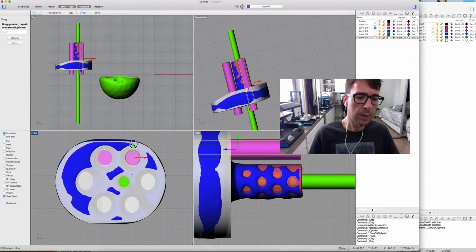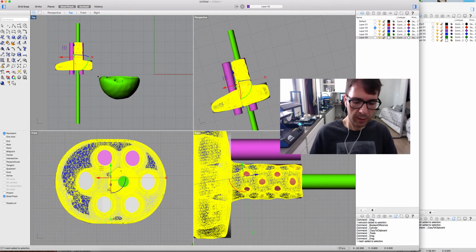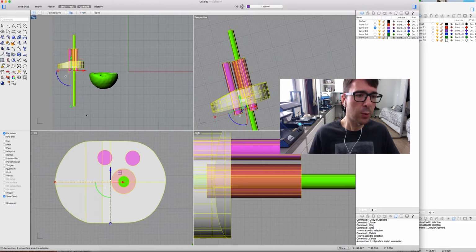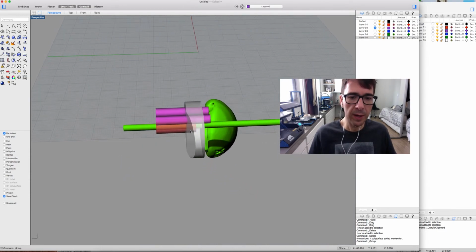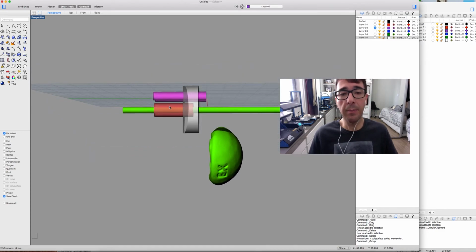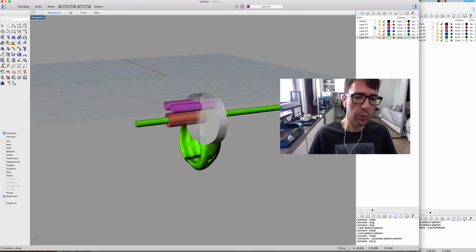Okay, so now I'm going to delete the implant. I'm going to delete this line, and here you can see that we have our implant designed. We have the base plate in the correct dimensions. We have the central pin, the peg, the central pin guide for the location, and the screws we want.